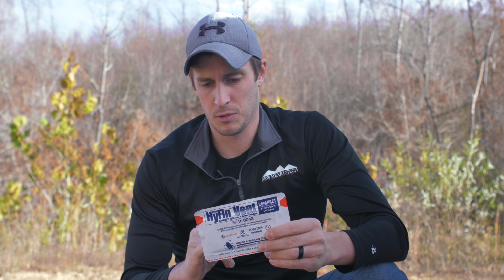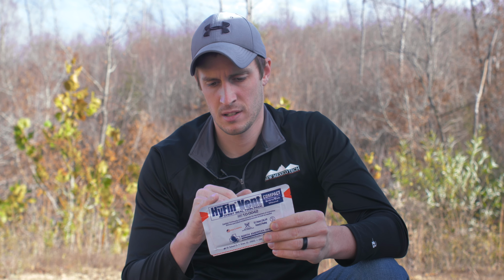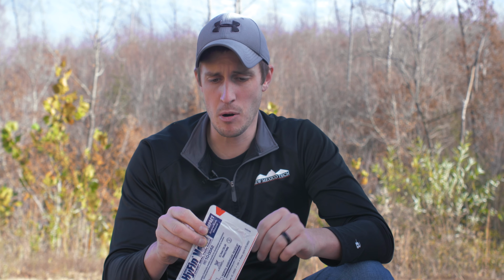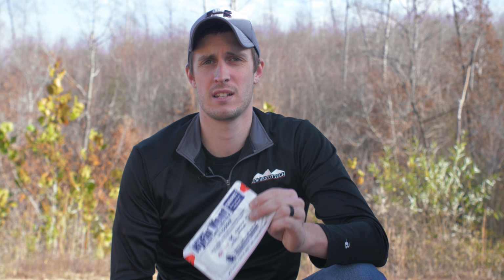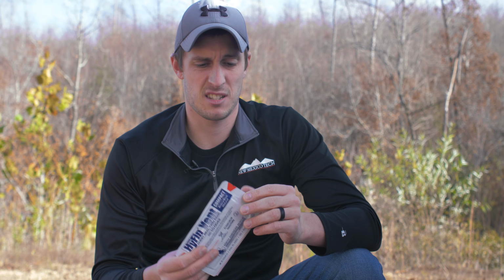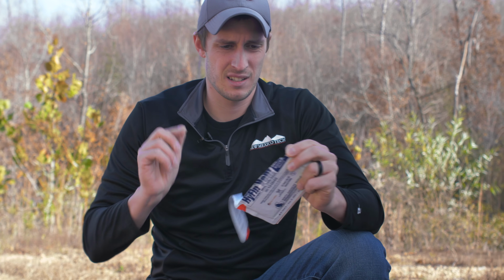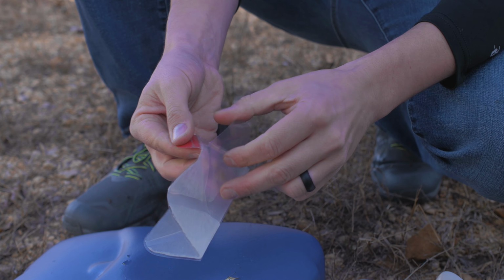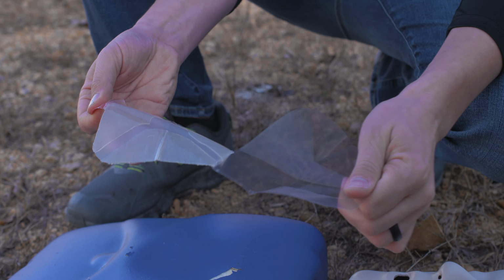All right, so now we've got another one that's 2 years old from December 9th, 2020, and we just pulled this out of a smoker that was 126 degrees at the time we pulled it out. It's been sitting in there for the last 30 minutes, so let's see if temperature affects this at all. Oh, there's that perforation again.